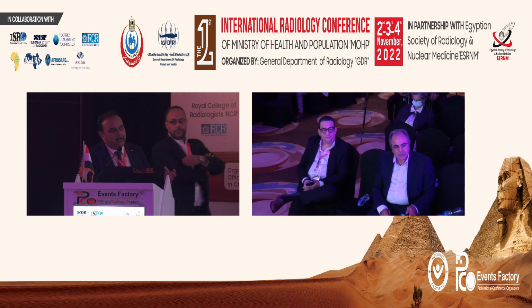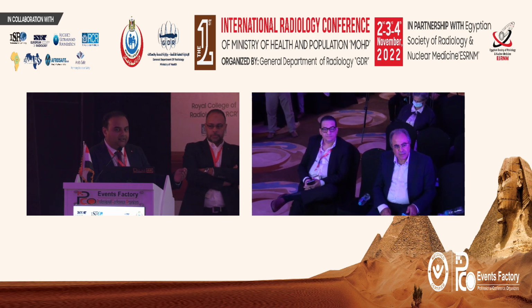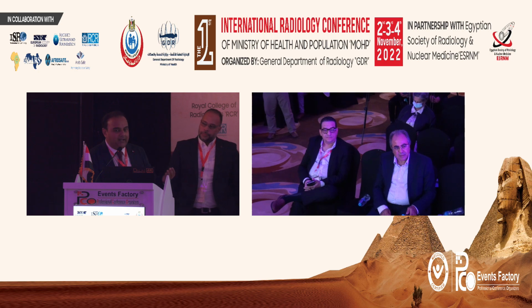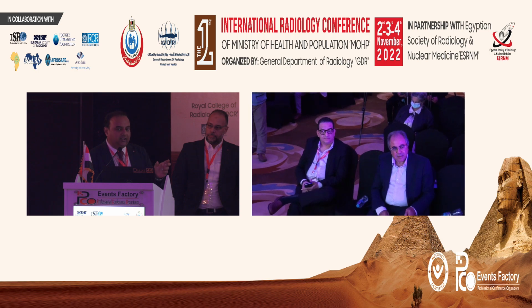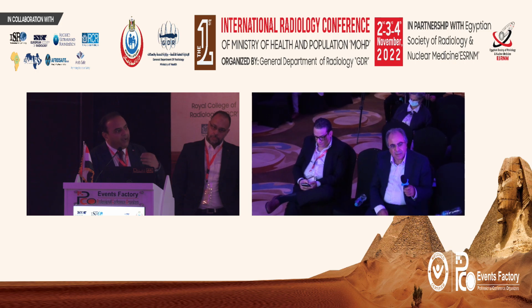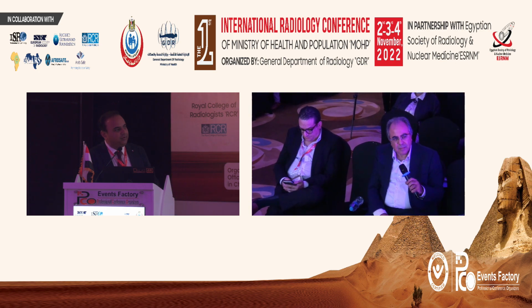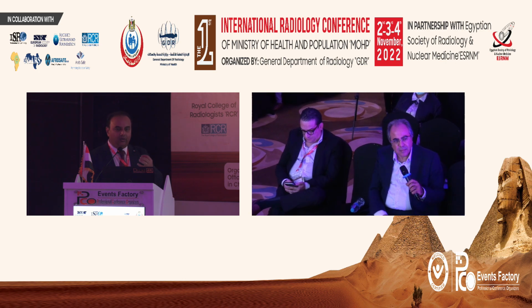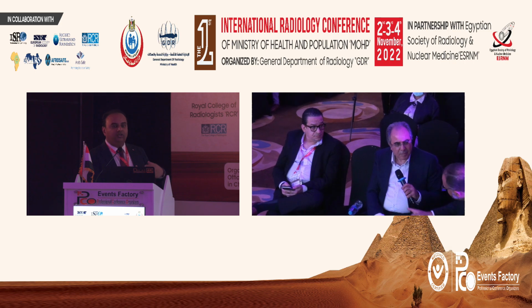I think one area where IRE has a lot of potential is margin accentuation for borderline resectable pancreatic cancers. We've done a pilot study on that, and we demonstrated a significant survival benefit when you do margin accentuation prior to doing a Whipple's. Within the liver as well, it expands the scope for extended liver resections. For example, the one I showed where a patient is having an extended right hepatectomy but also has a lesion in a critical place sitting on the left hepatic vein, which is a solitary remaining outflow. In those patients, you could use IRE as a way in which you can offer more curative resections.